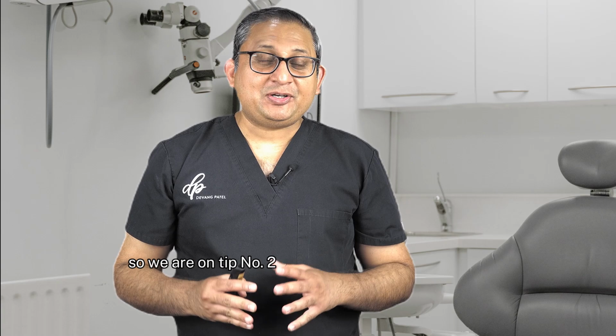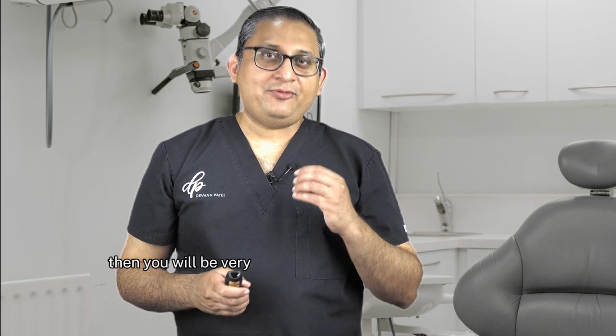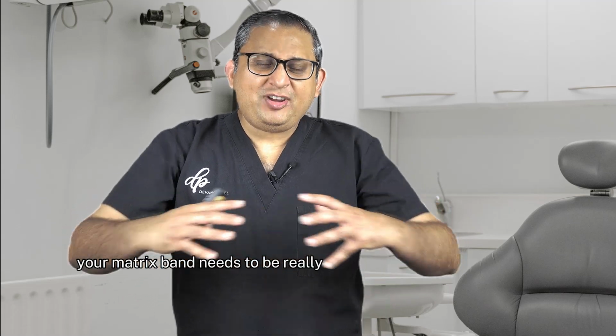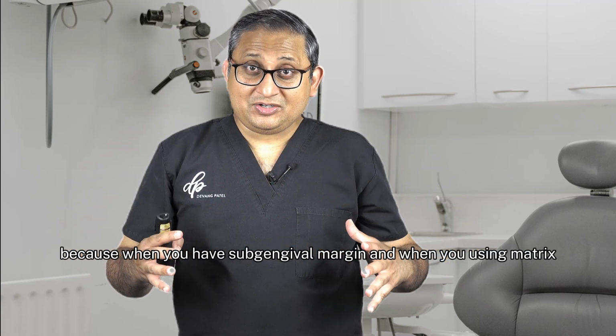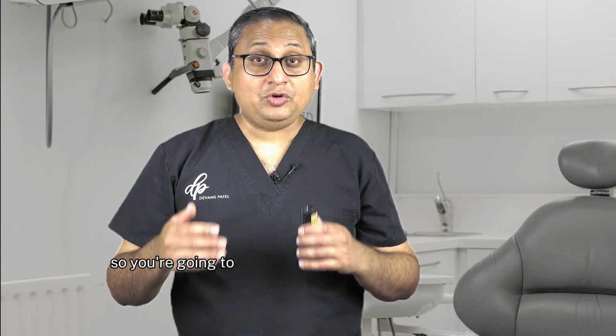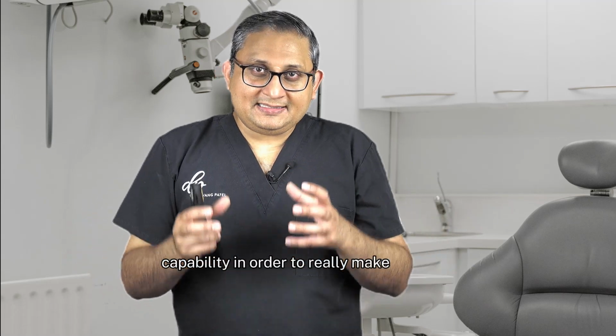Okay, so we are on tip number 2, and this is the most crucial tip. If you ignore everything else but keep this in mind, then you will be very good at doing deep margin elevation, which is: seal is the king. This means that your matrix band needs to be really well adapted towards the box. And there will be difficulty in using a wedge, because when you have a subgingival margin and you're using a matrix band, you can't really push the wedge below your box, even more subgingival. So you're going to struggle in some cases to put in a wedge so that you can really isolate the area. So you rely on your matrix band's capability to really make that seal.